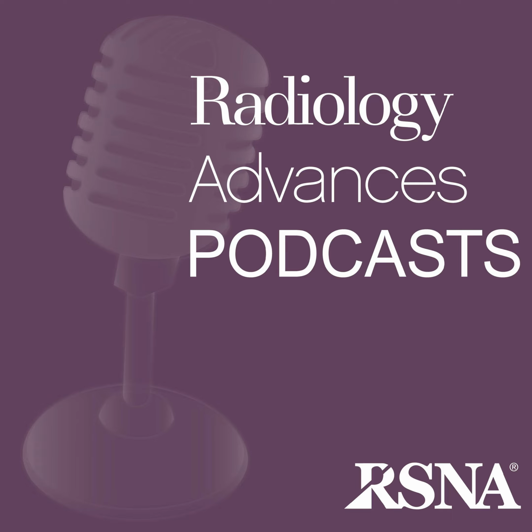Here's where it gets really interesting, because to understand this, we have to think beyond what we normally do. Typically, we use conventional B-mode imaging, which is all about the amplitude of the echoes coming back. And we also use tissue harmonic imaging, THI, to try and clean up that signal and reduce the clutter. But THI has a major weakness, which the paper points out. It does. Its improvement is much, much better in fatty breast tissue. For women with dense breasts, who are already a higher risk, harder to screen group, THI just doesn't help as much. Which brings us to short lag spatial coherence imaging, SLSC.